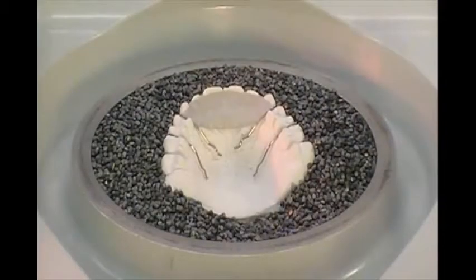Adjust pellets within the cup to elevate the model. For a Hawley retainer, the top tooth surfaces should be at the height of the cup's rim. Fill the gap between the model and the cup's rim with pellets.